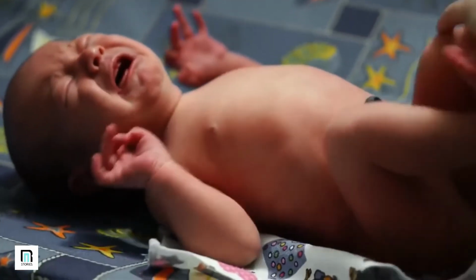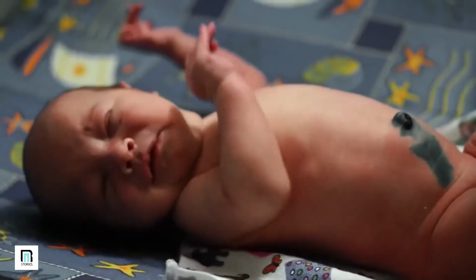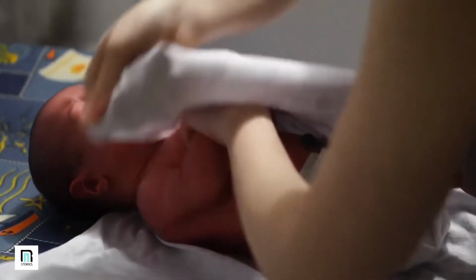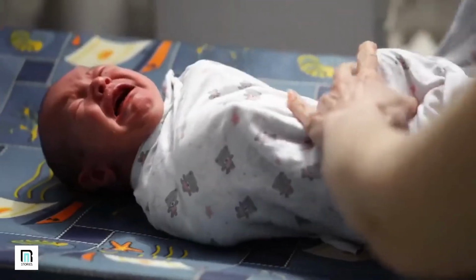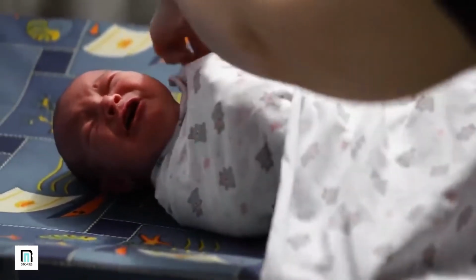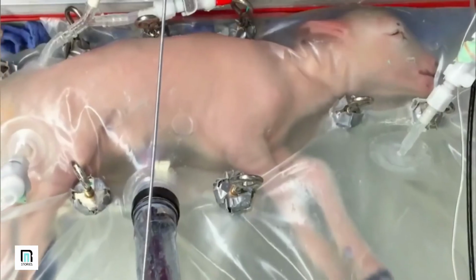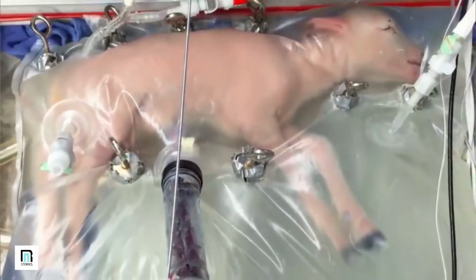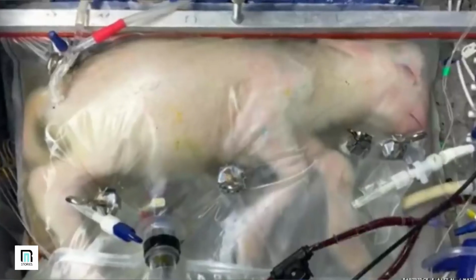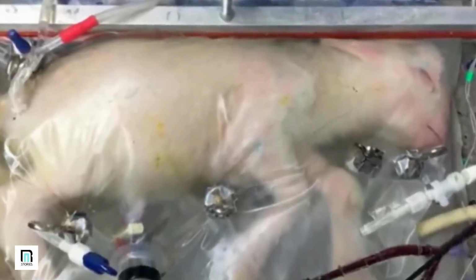For their human device, Flake's team hope to improve the fluid that babies will be bathed in. Amniotic fluid contains nutrients and growth factors as well as fetal urine. The team plan on adding substances that are known to aid the development of the gut, for instance. The human device will look different too. I don't want this to be visualized as fetuses hanging on the wall in bags, says Flake. He says the device will eventually look like an incubator, with a cover and a dark interior.